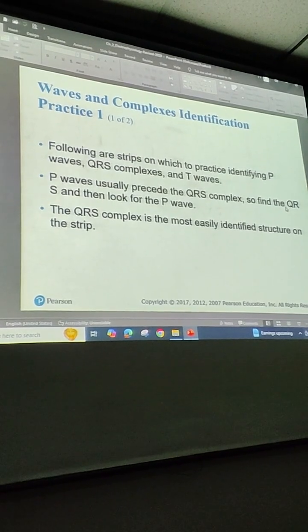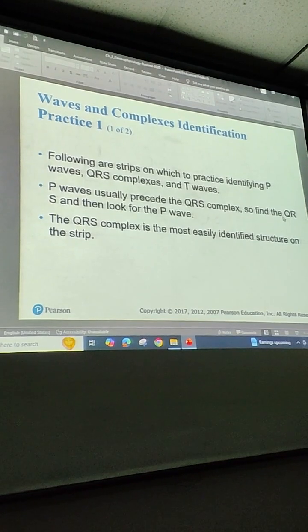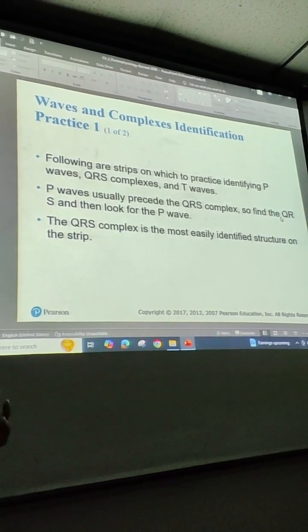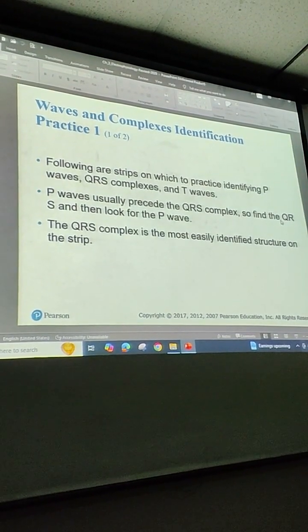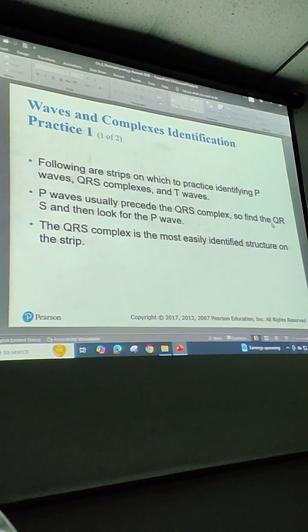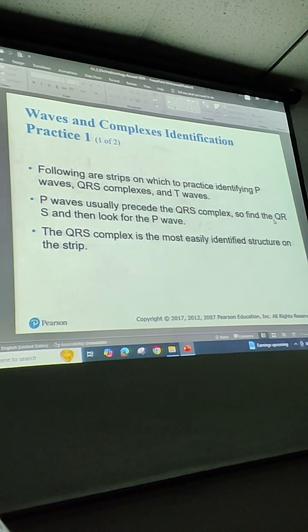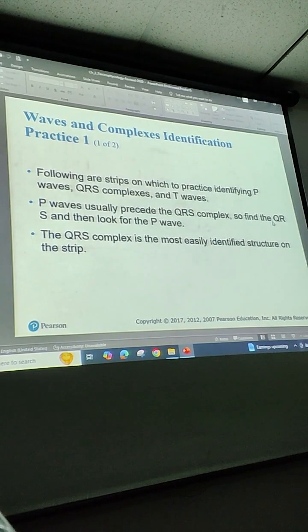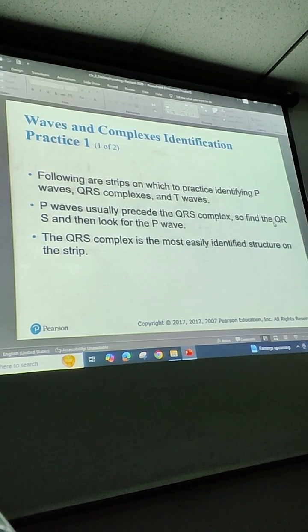The problem with the EKG is sometimes it doesn't capture what's really going on, or what has already happened. Let's say that you just have chest pain. You were having some pre-heart attack, let's put it that way. Then I do an EKG. Now you're feeling a little better. It's not going to show up. It's going to show up if you're having it right now, or if you had a heart attack back in the days.